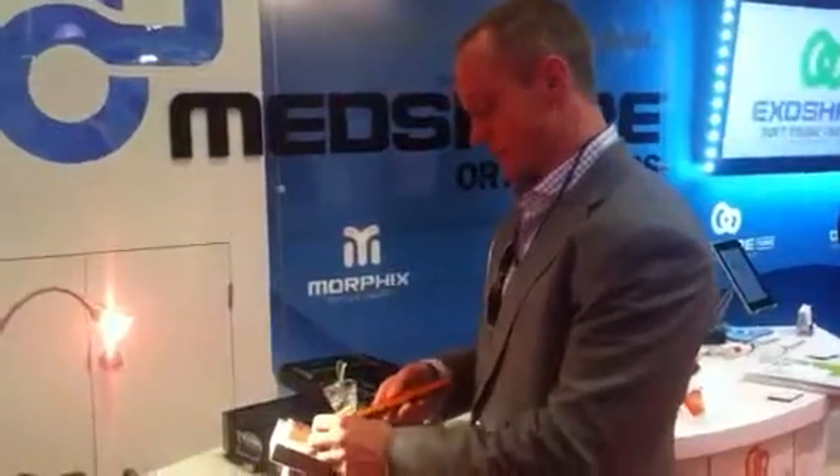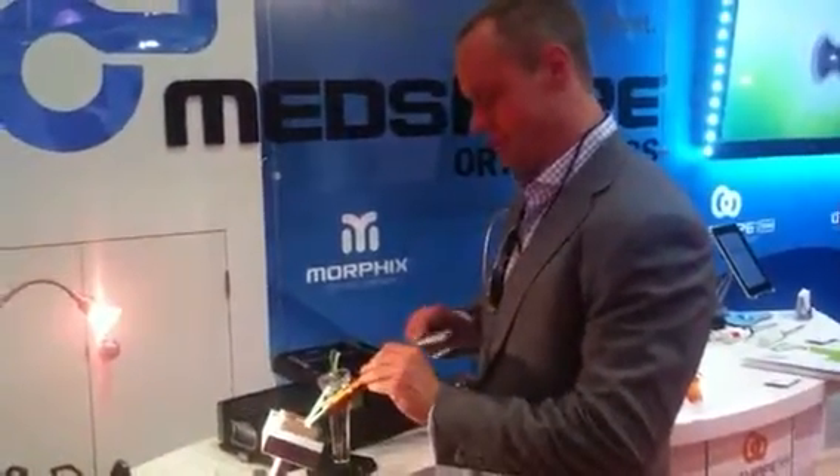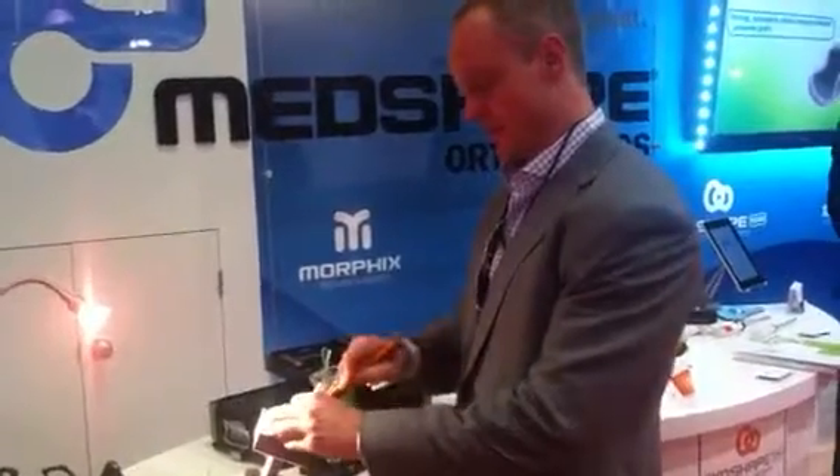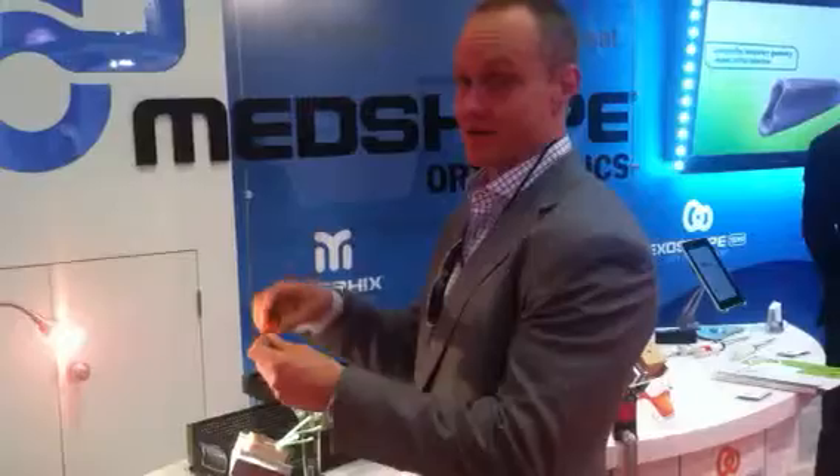Let's take a dilator. This dilator helps you understand what size implant you're going to use. Bring the dilator in, tap that in. It feels like a snug fit — that's the size you use. This dilator is a 9mm.